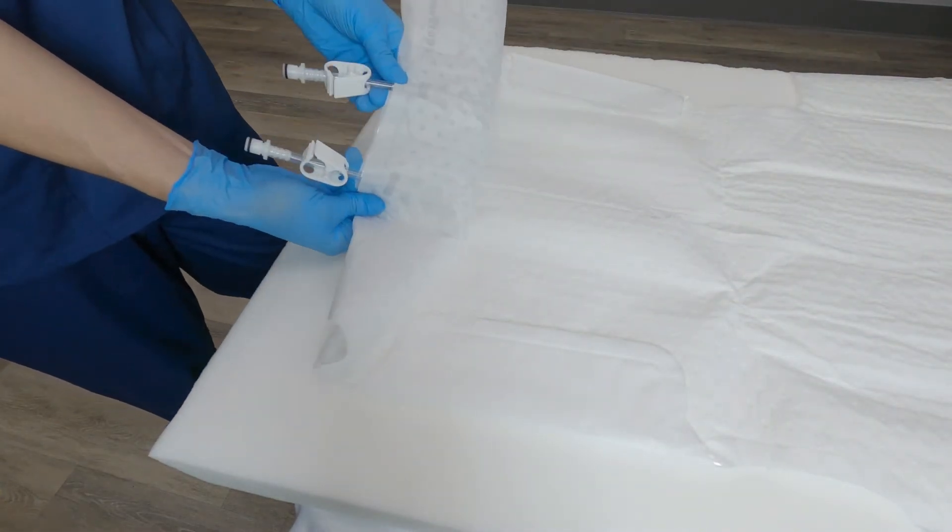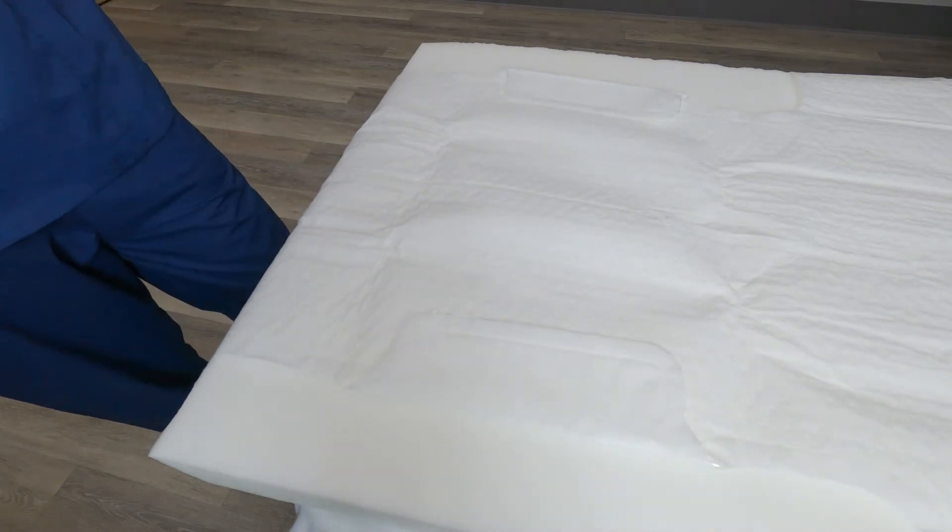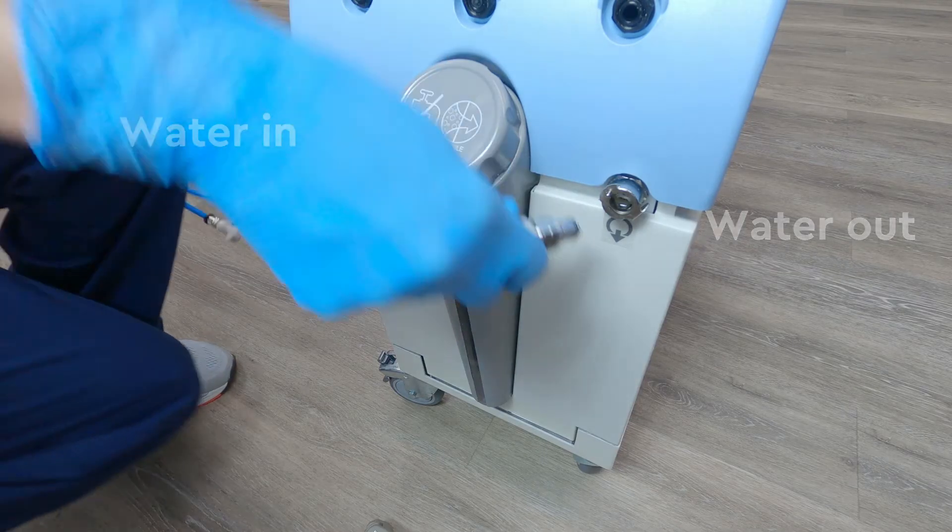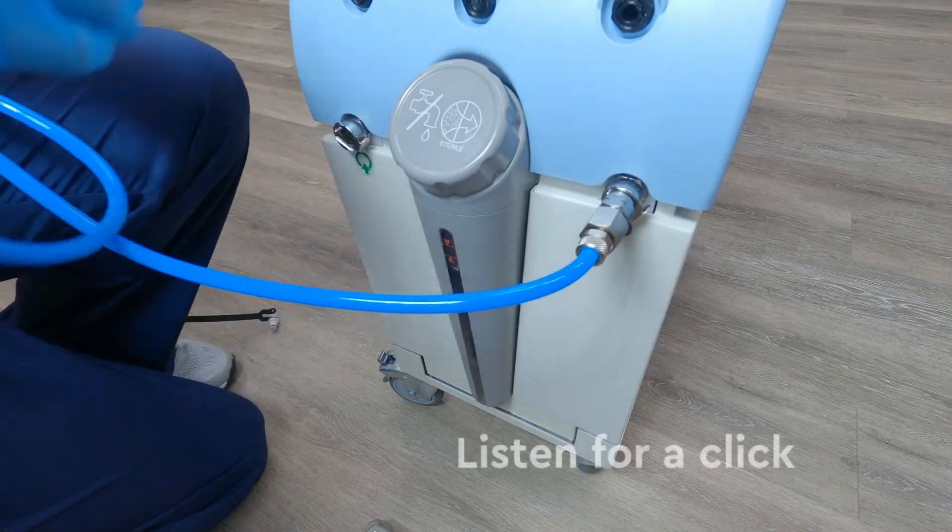Confirm that the clamps are open to allow the water to circulate. Connect the hoses to the machine on one end by connecting metal to metal. Listen for the click.